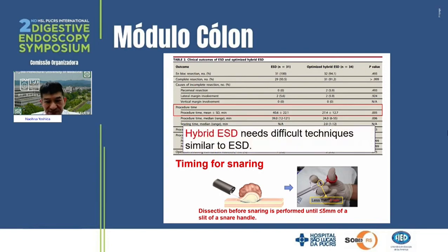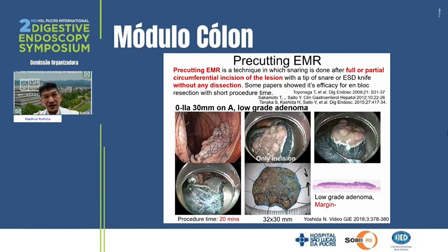However, I think hybrid ESD needs some submucosal dissection. It means hybrid ESD is difficult, similar to ESD. So we need another resolution for that.